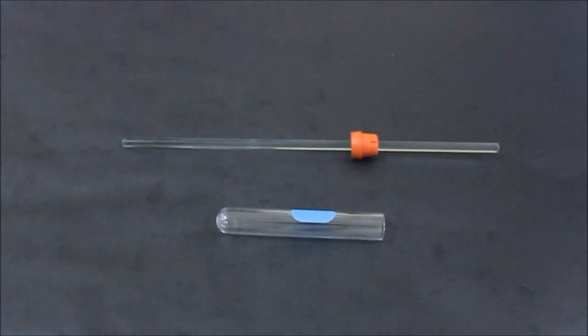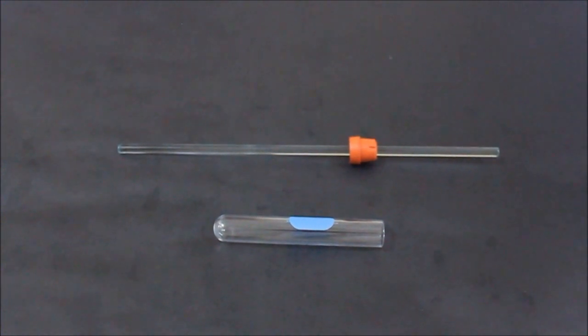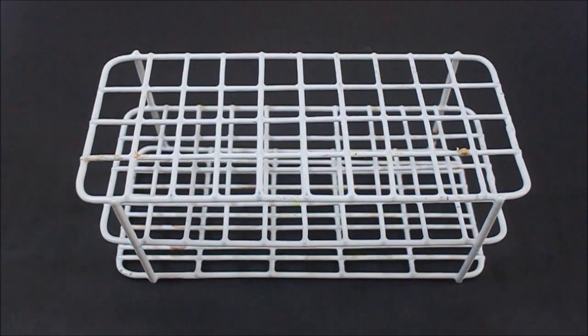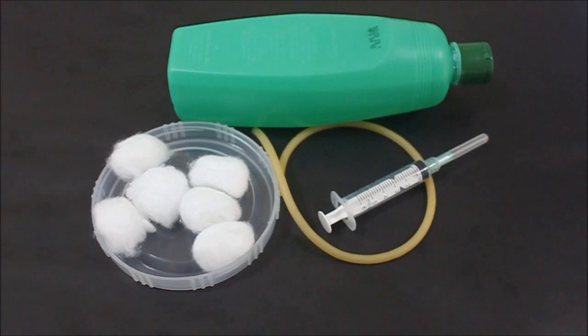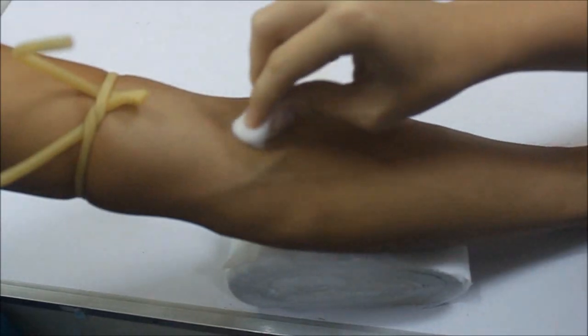Clot retraction time is the time required for blood to shrink. The materials needed for the McFarland modification are test tube, stirring rod fitted into a cork, test tube rack, and materials for venipuncture.